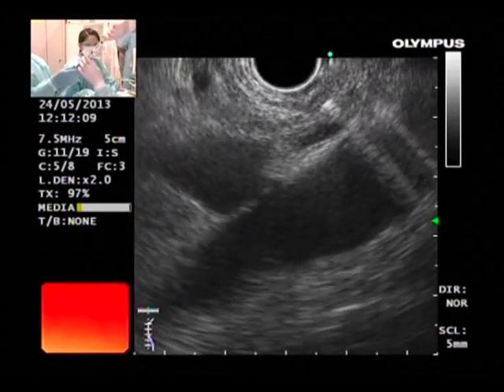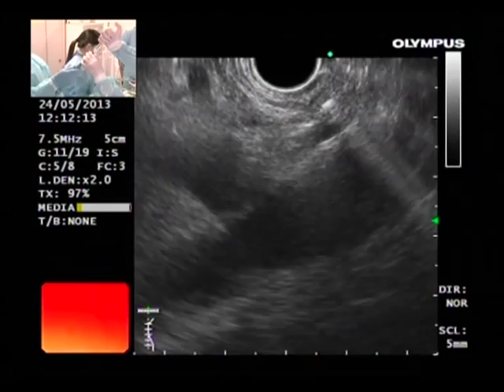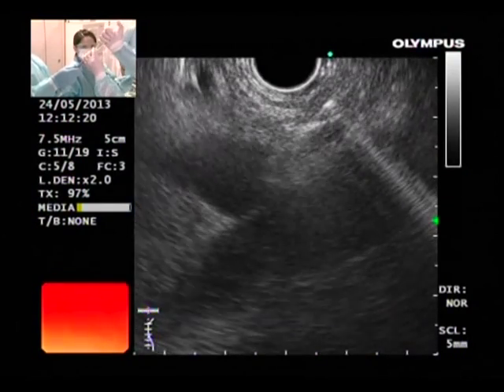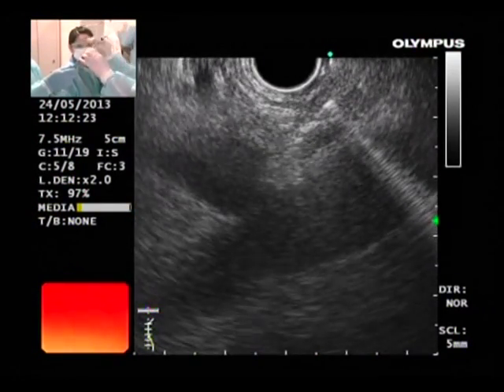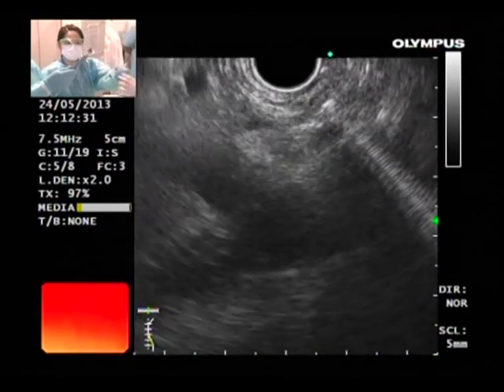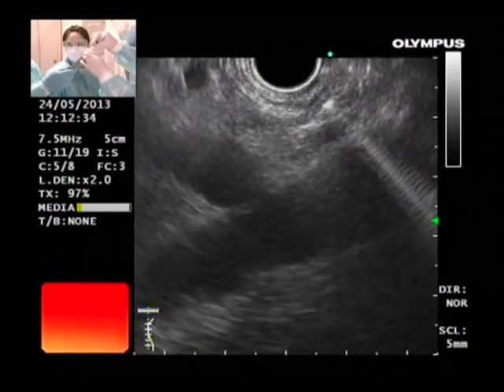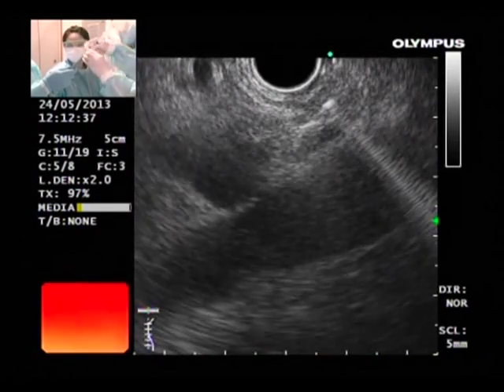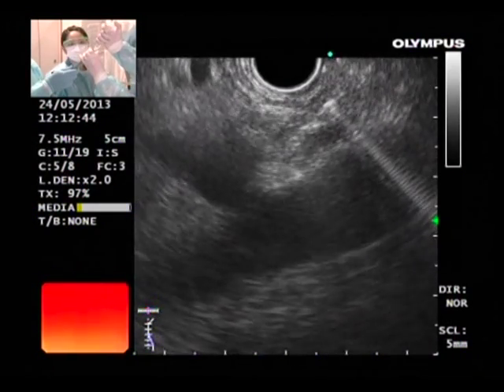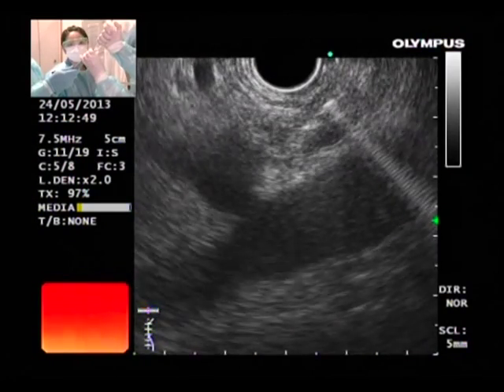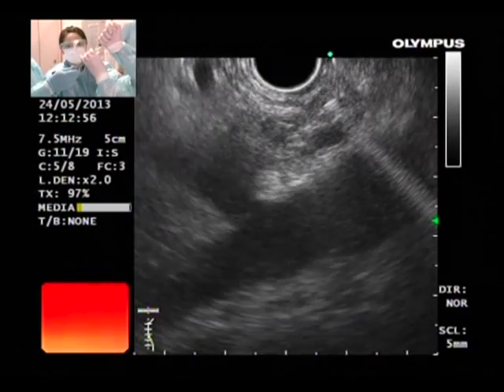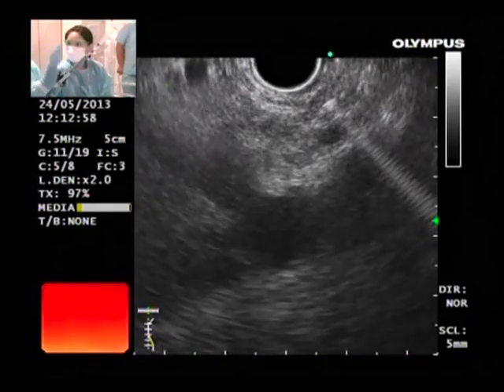This looks okay. We are using 0.25% bupivacaine, 5 mils, mixed with absolute alcohol. You can see it getting white now. We have injected enough so far. Because we are going directly into the ganglia, we do not have to inject too much — about 2 mls of ethanol. Before injection of bupivacaine and ethanol, we prime the needle with normal saline, and after injection we push the remaining drug through with normal saline so that all the absolute alcohol goes into the ganglion rather than being left in the needle.